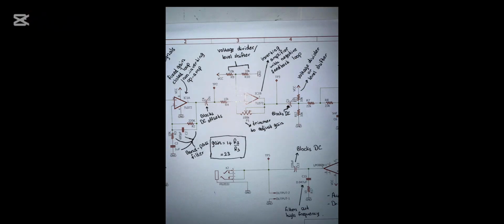In stage 2, the amplified signal enters IC1B, which is also a part of the TL072 IC. This op-amp is patched as an inverting amplifier using a negative feedback loop. The signal enters the negative terminal while the voltage divider R9 and R10 supplies 4.5 volt through the positive terminal. The negative feedback loop means a portion of the output voltage is sent back into its negative input terminal with a phase inversion of 180 degrees. The output waveform will be 180 degrees out of phase with the input waveform.